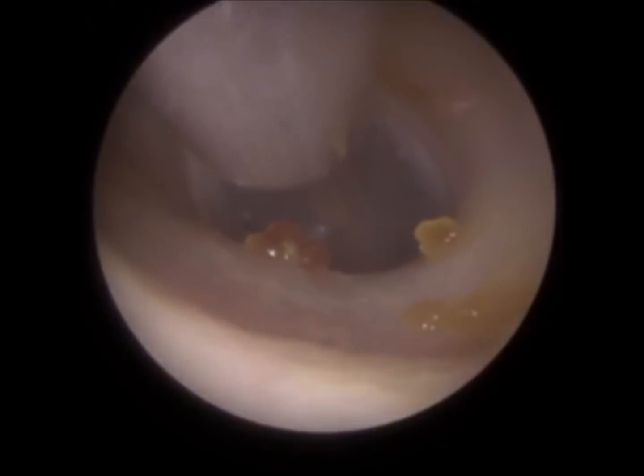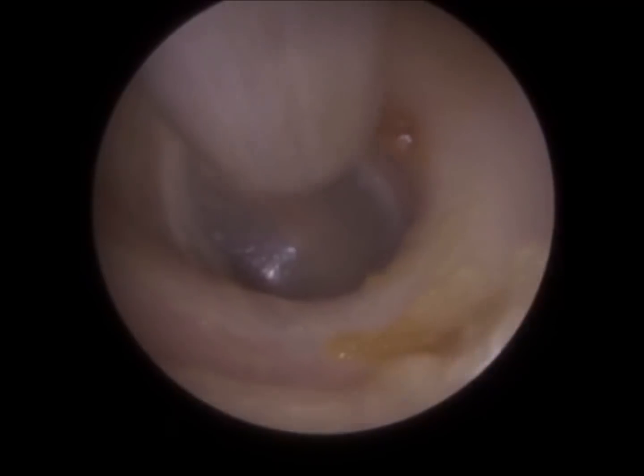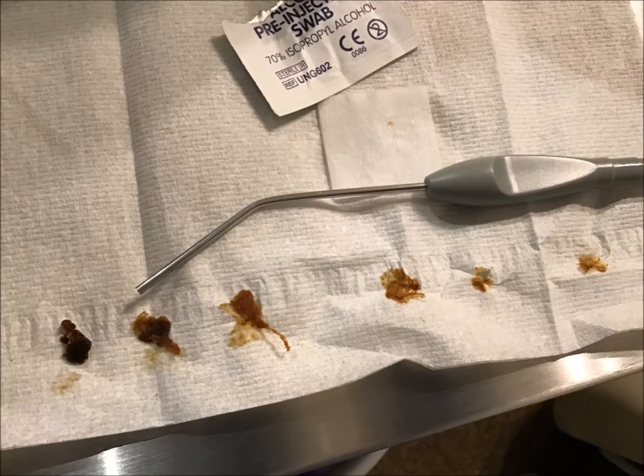So I'm just re-entering, just very quickly hovering over. You can see the endoscope's not even in the ear, it's just literally on the outside. Nice and healthy eardrum. And there's the remnants of the wax. So the wax was quite sticky and wet, so I was able to take an image.